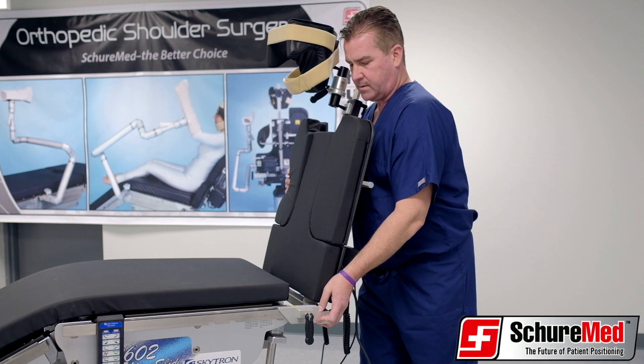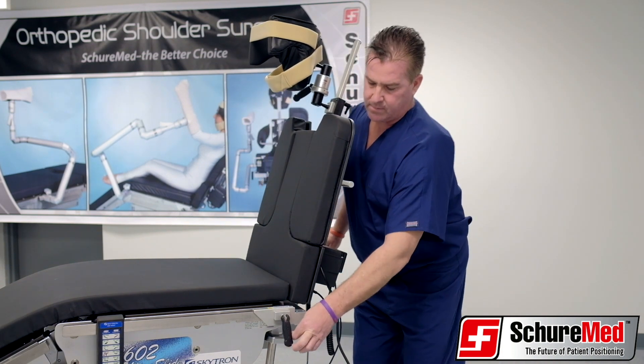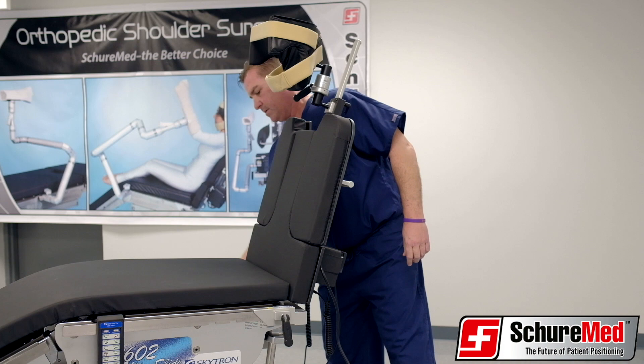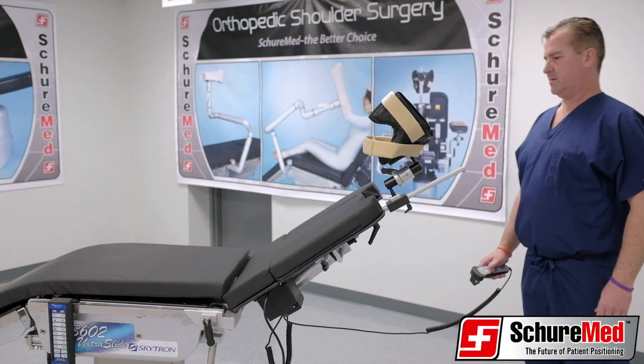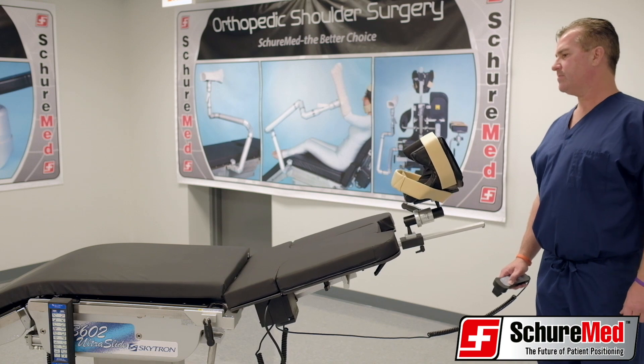Slide the beach chair completely onto the side rails. Lock by turning the handles to the right. Plug the chair into a 110-volt outlet, then push down on the hand control to lower the chair to the supine position.